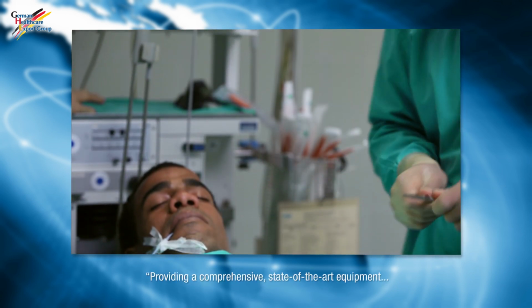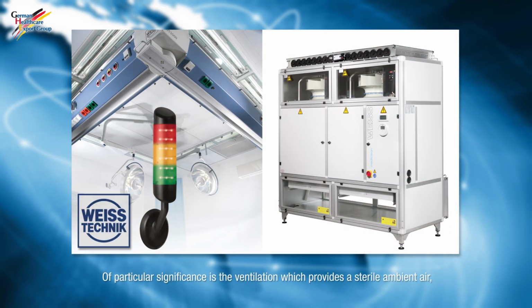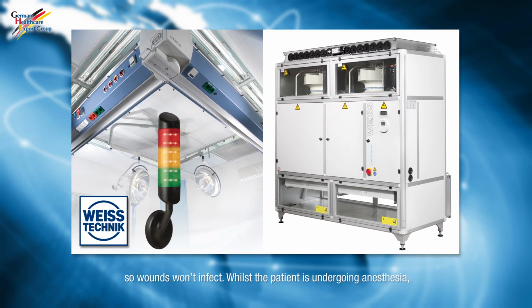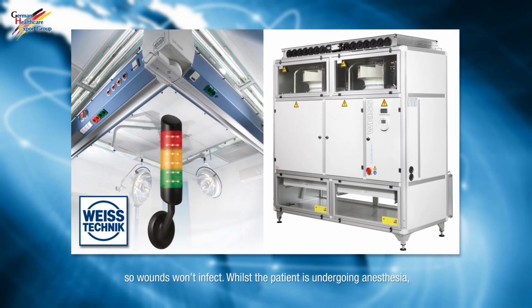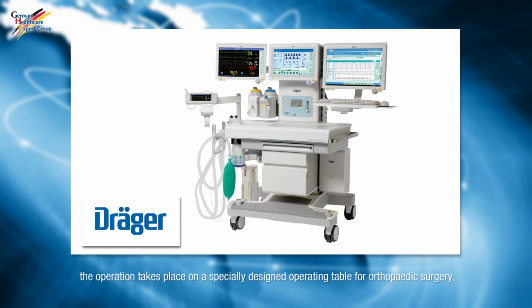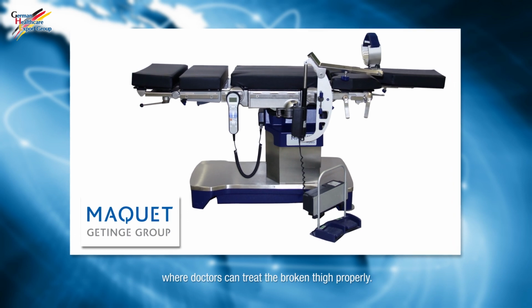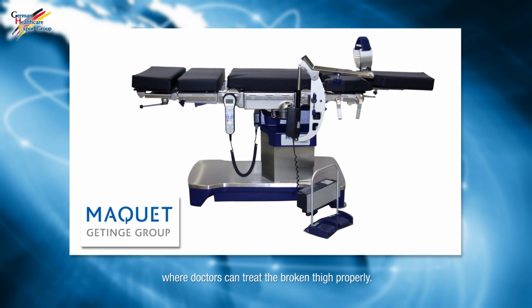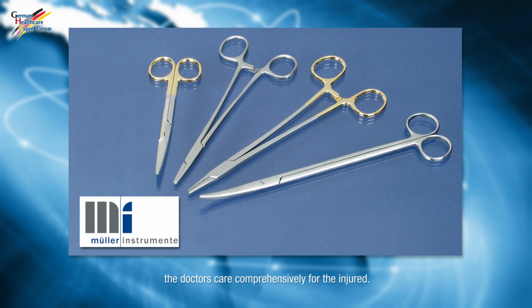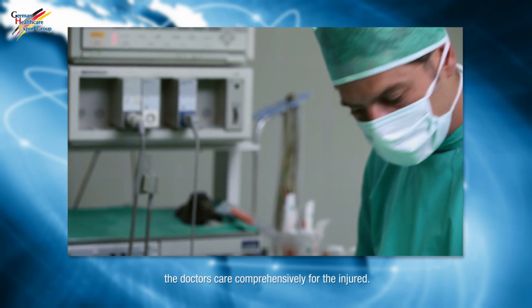Providing comprehensive state-of-the-art equipment in an operating theater is very important. Of particular significance is the ventilation, which provides sterile ambient air so wounds won't infect. Whilst the patient is undergoing anesthesia, the operation takes place on a specially designed operating table for orthopedic surgery, where doctors can treat the broken thigh properly. With the support of the latest technology, tools and instruments, the doctors care comprehensively for the injured.